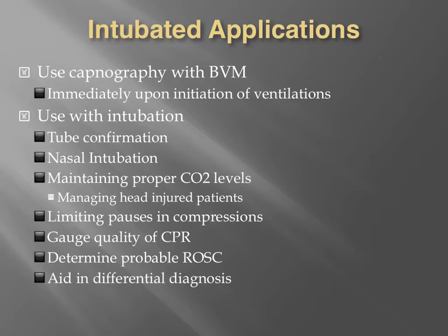However, for the majority of our patients who have head injuries and associated trauma with the rest of the body, we really need to control ventilations so that we're not making them hypocarbic, or hypercarbic for that matter. So hyperventilation is not necessarily the enemy. Hypocarbia is. And on the flip side, hypercarbia is, which would be related to hypoventilation in many instances.